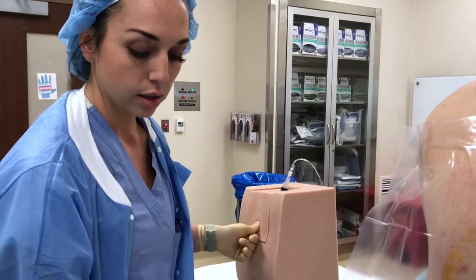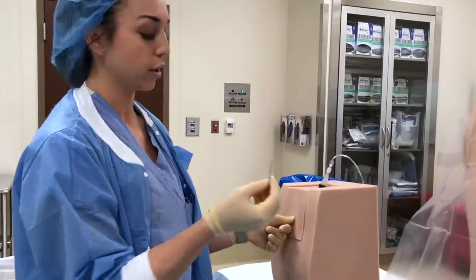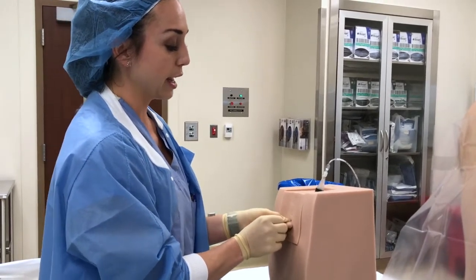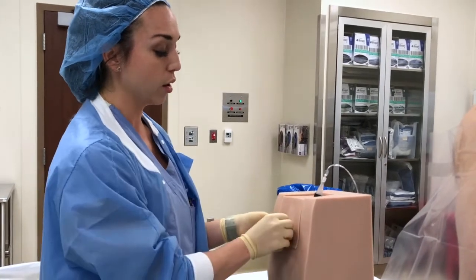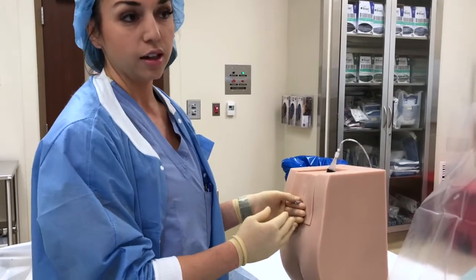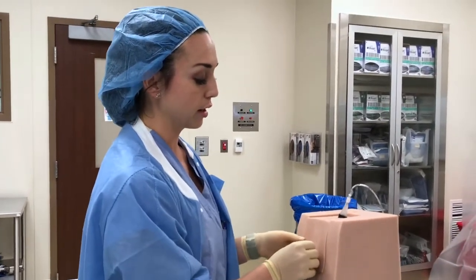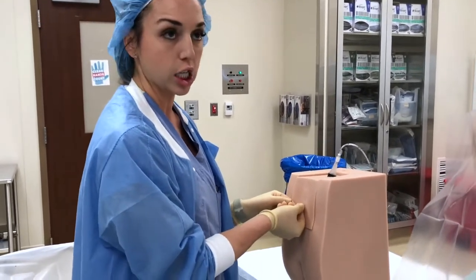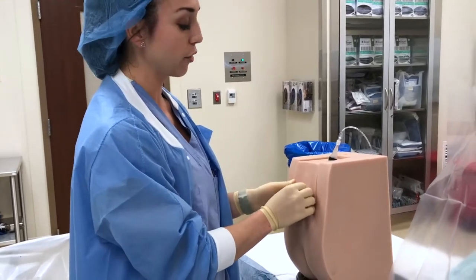The next step in this process is going to be using the introducer needle. We take our introducer needle and gently place it midline. And for most patients, you can hub this needle. Now, be careful if you do have someone who's exquisitely skinny, you may not be able to, so keep that in mind. But for most patients, they will do just fine with hubbing the introducer needle. It should feel nice and secure. So again, remember it's seated nicely into that interspinous ligament, which is that tough bristly ligament.